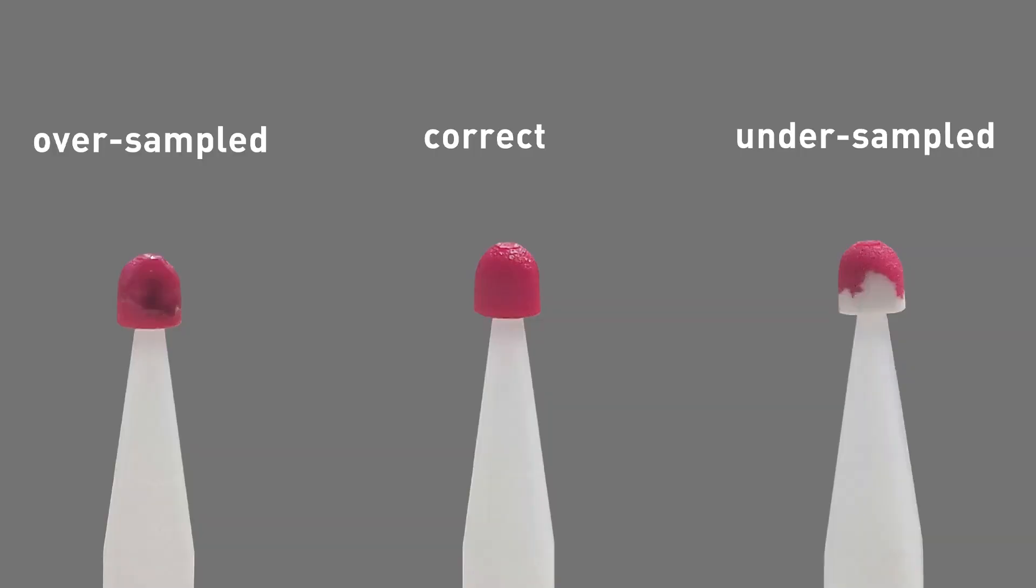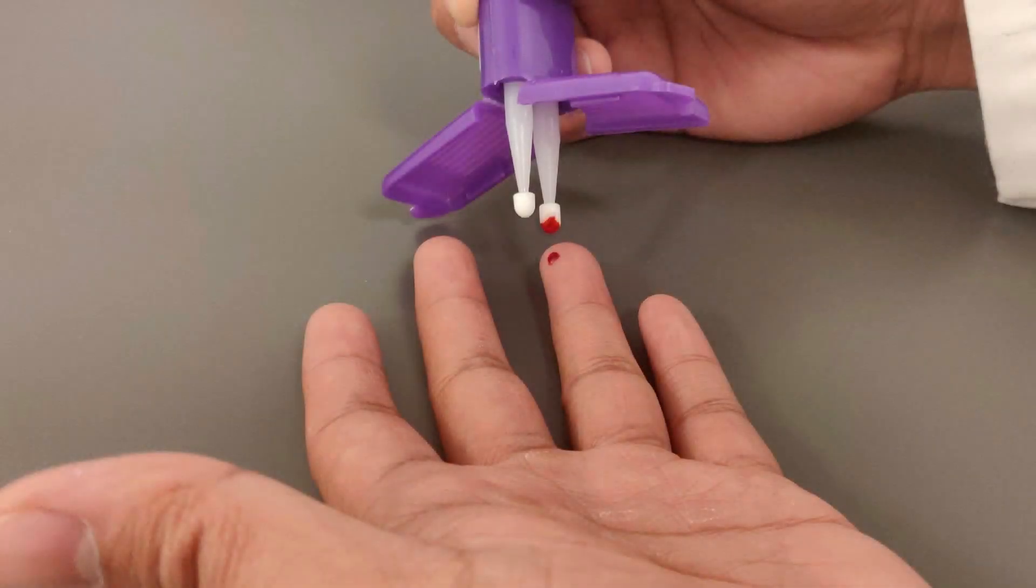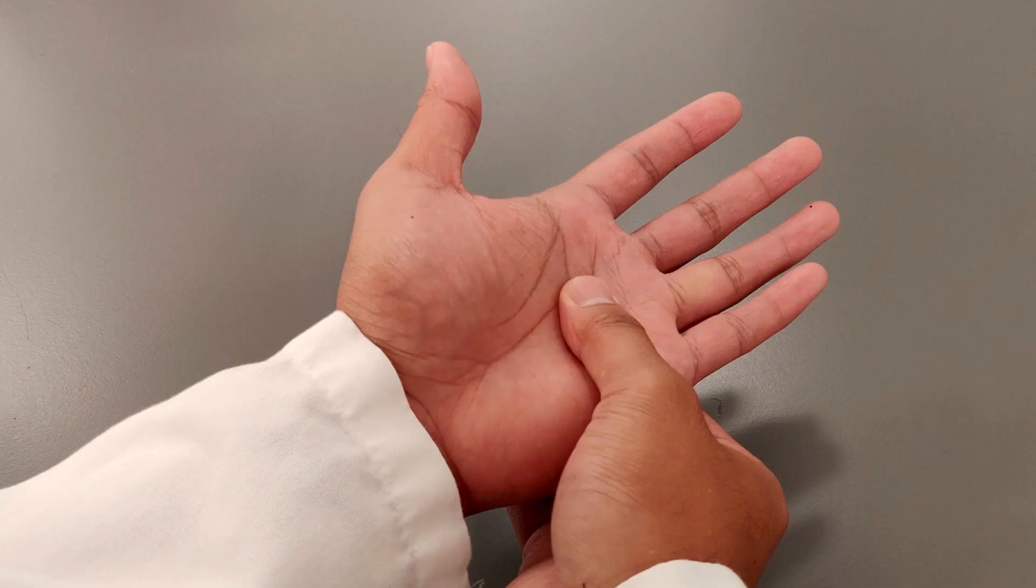To collect a sample that's just right without over- or under-sampling, follow these guidelines. Here's what an over-sampled and under-sampled meter tip looks like compared to a correct sample. If part of the meter tip remains white, that's under-sampling. Under-sampling can occur when you pull the mitra tip away from the blood drop too quickly or when there's not enough blood to fill the tip.